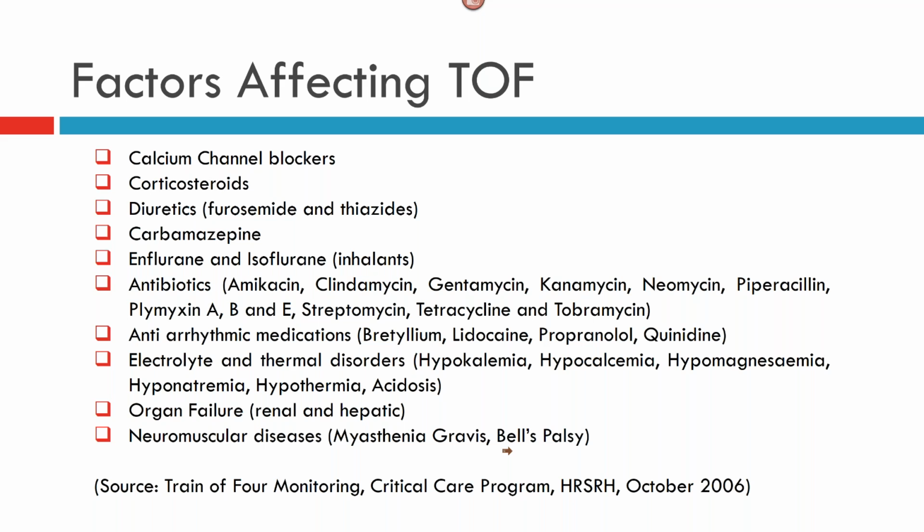So that's one of the reasons that in QA and all this, we stress going and checking the patient history. All these medications, if you don't have a good MEP or EMG or trigger EMG responses, then you know something is going on. Antiarrhythmic drugs, hypokalemia, hypocalcemia, hypomagnesemia, all the electrolyte imbalances, or if the patient has renal or hepatic failure, or myasthenia, or especially neuromuscular diseases, you'll have some changes.